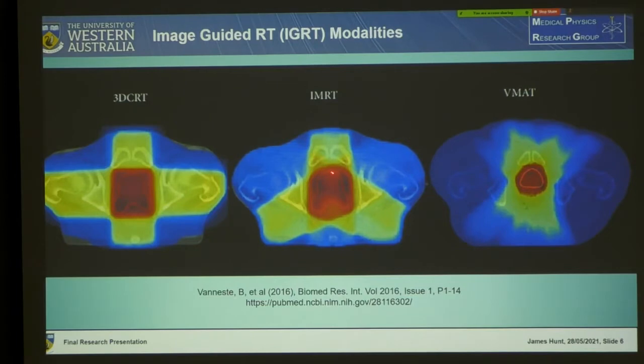IMRT, its specialty in IMRT, you use a multi-leaf collimator to adjust the shape of the beam as well. And you also target from chosen angles. So here, potentially, they've targeted from 3 angles, and they would have modified the beam. So rather than just having to increase the focus to the prostate while sparing around the prostate.